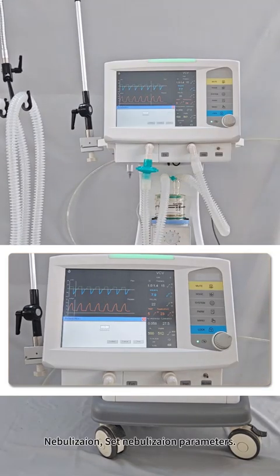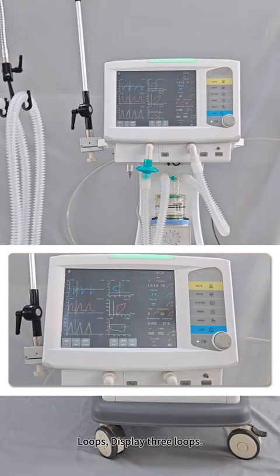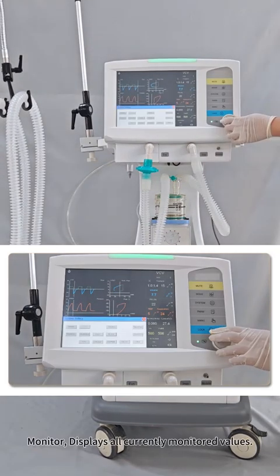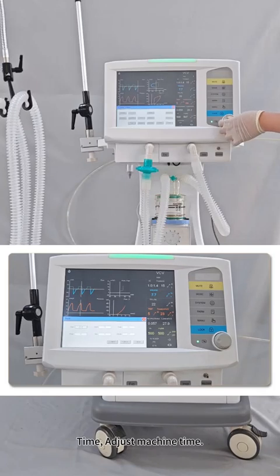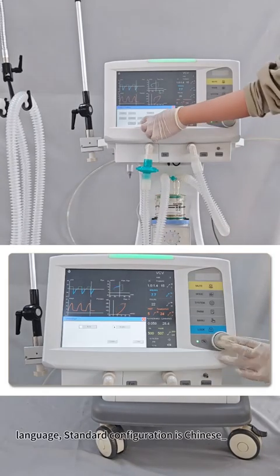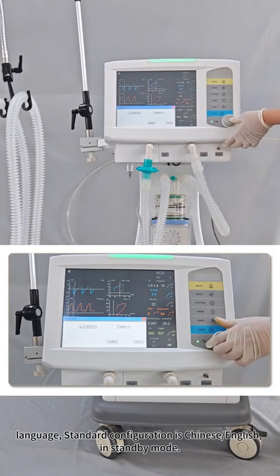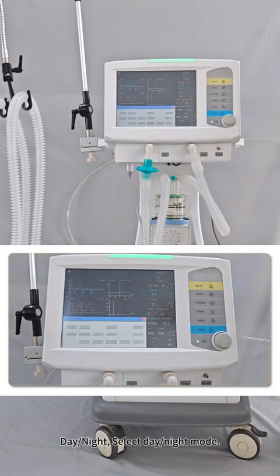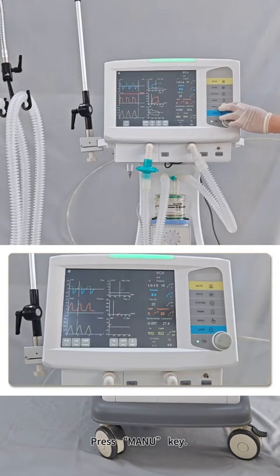Nebulization, set nebulization parameters. Loops, display 3 loops. Monitor, displays all currently monitored values. Time, adjust machine time. Language, standard configuration is Chinese/English, in standby mode. Day/night, select day/night mode.